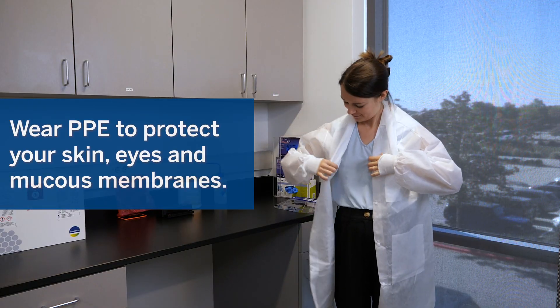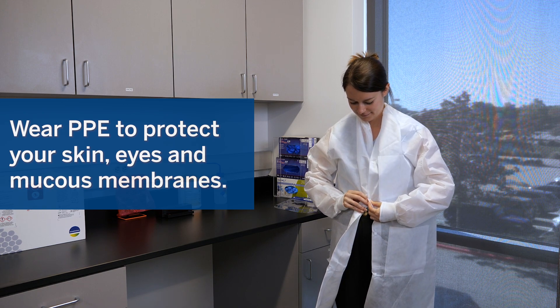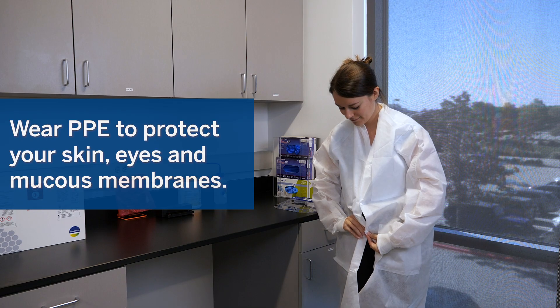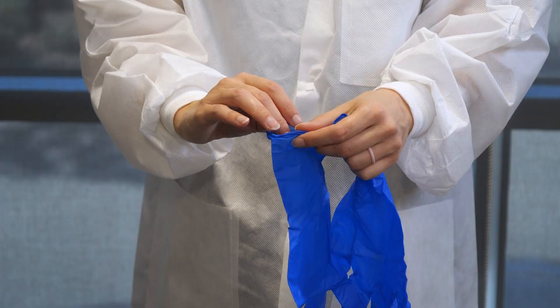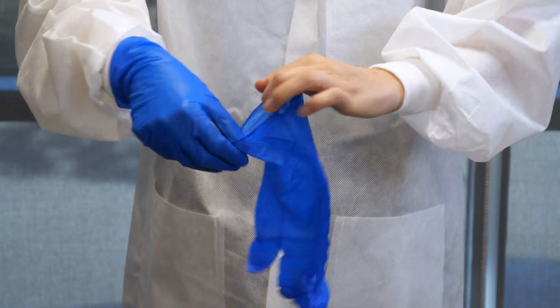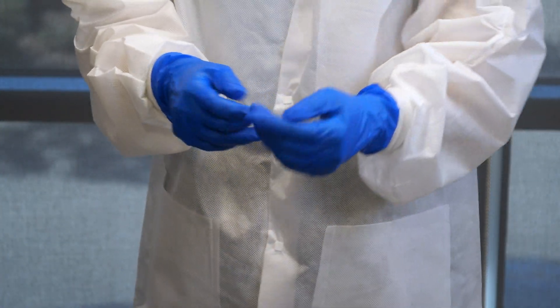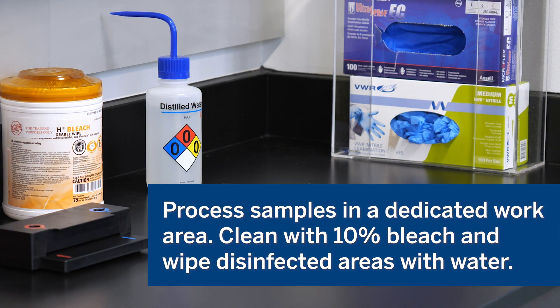Always wear appropriate personal protective equipment, or PPE, including but not limited to disposable clean, powder-free gloves and a lab coat. Be sure to protect your skin, eyes, and mucous membranes. Samples should be processed in a clean biosafety cabinet if available, or according to local laboratory guidelines. If a biosafety cabinet is not used, a dead air box, a splash shield, or a face shield can be used when preparing samples instead.